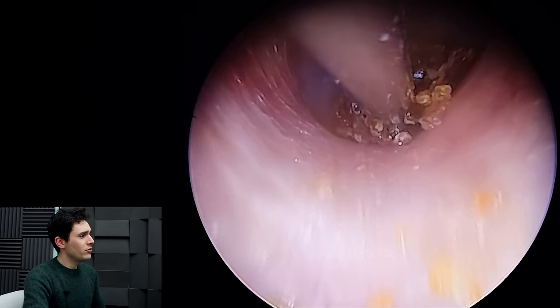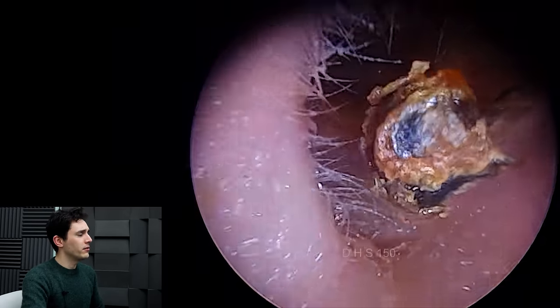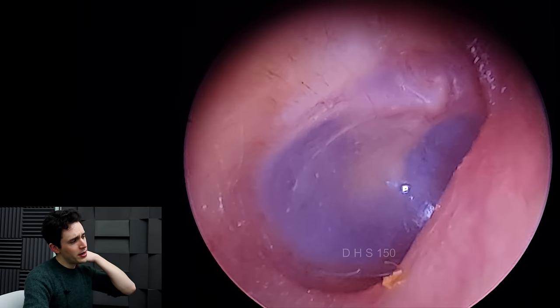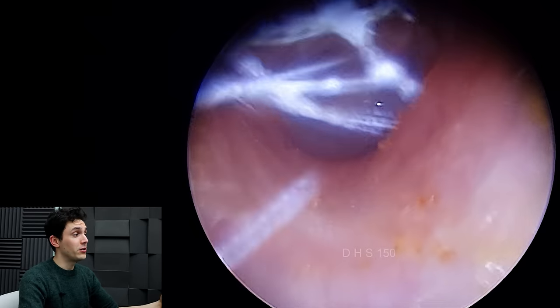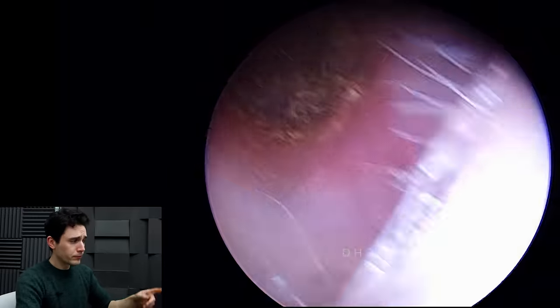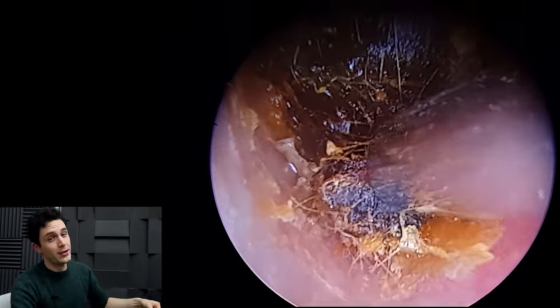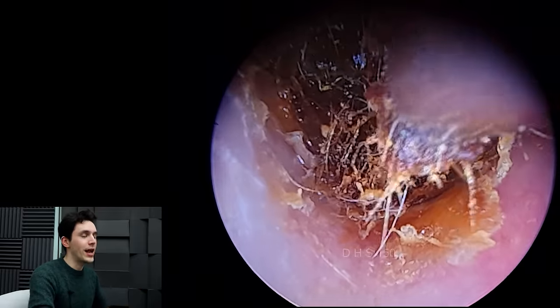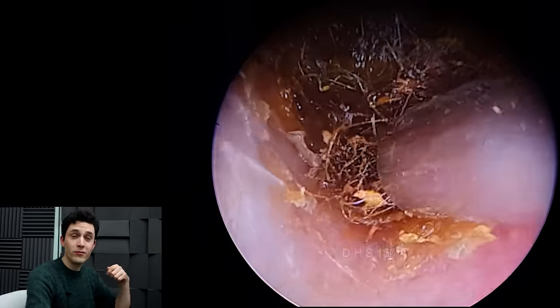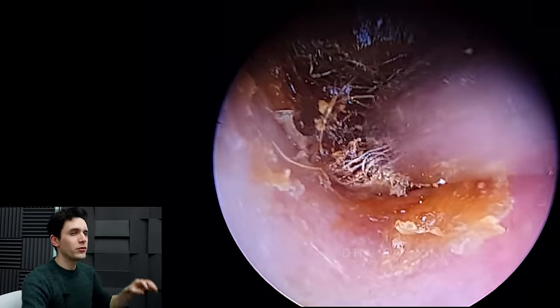Last little bit near the eardrum, and a nice looking eardrum revealed there. Fairly clean looking ear. So this side was obviously bothering the patient quite a lot, but his next ear — this is the right ear. The left ear was also bothering him, but he was getting a lot of pain on this side. This was really agitating him. He had taken lots of painkillers to no avail, tried to fix the job himself with cotton buds, which just made the pain a lot worse. And you'll see why.